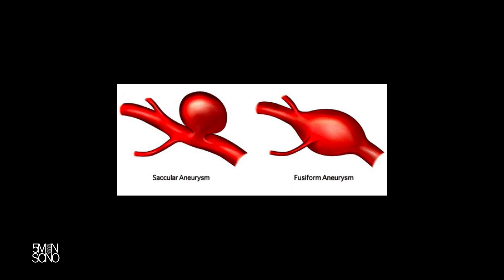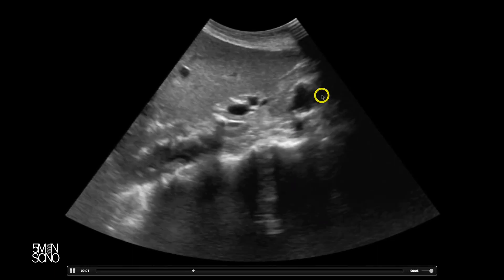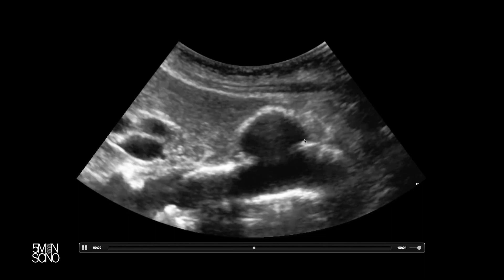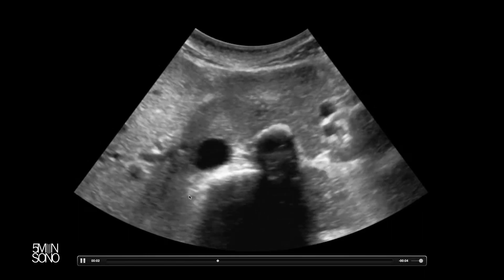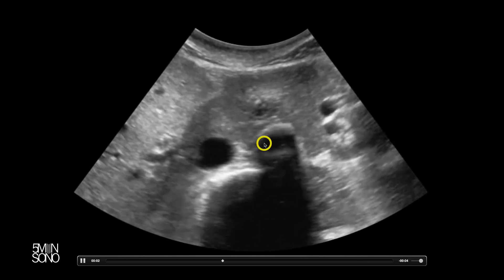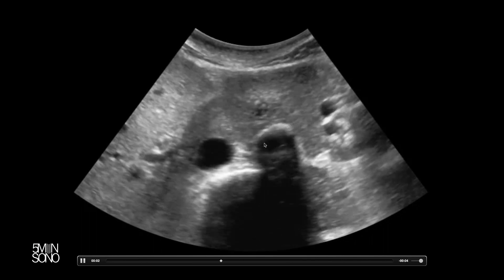Up until this point, we've only been talking about fusiform aneurysms, which are the most common by far. Saccular aneurysms definitely occur, and that's the reason why it's important to scan the entire aorta. Here is an aorta in long axis — the heart is over here, here's the liver. If we had only scanned up to a certain point, we might've missed this little aneurysm that's all the way over here. That's why it's important to scan all the way down. Here it is zoomed in — a saccular aortic aneurysm. In short axis, it looks pretty normal, and then you get this weird little outpouching right here. Whenever I see something like this, I always turn to a longitudinal view just to confirm it's a saccular aneurysm and not just an ectatic aorta.